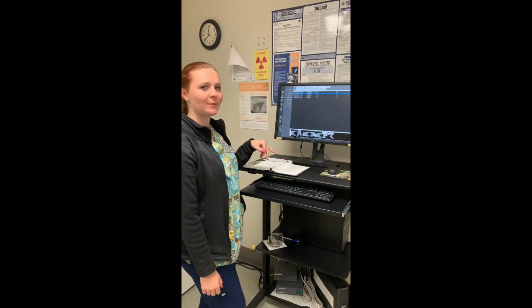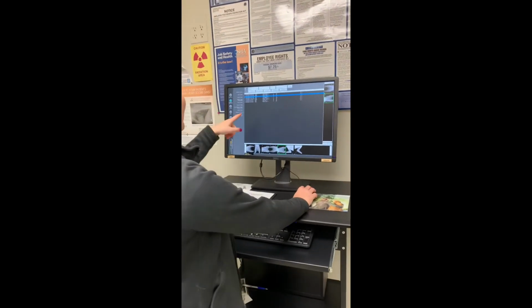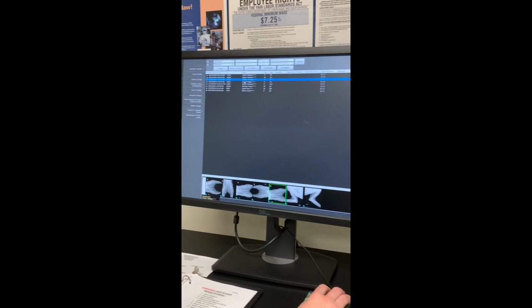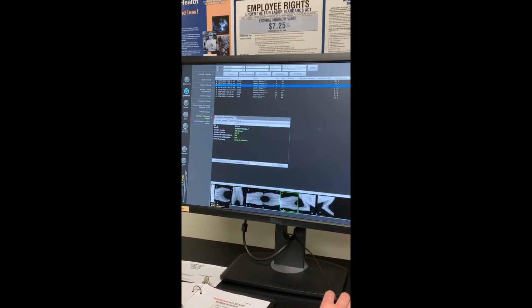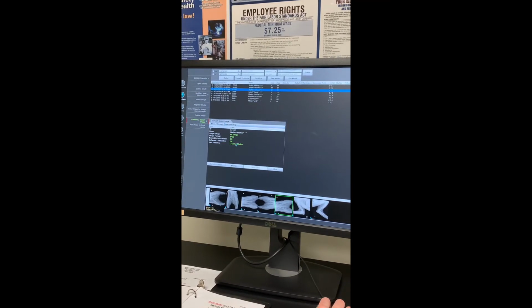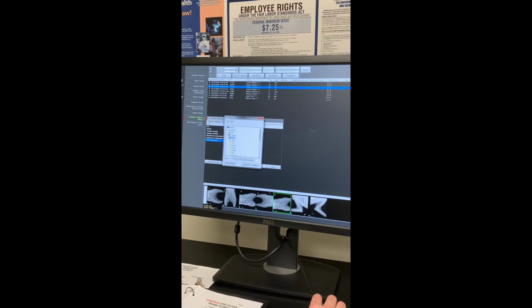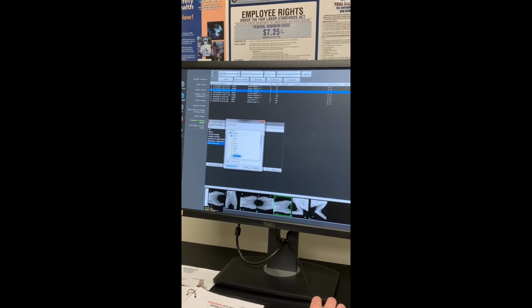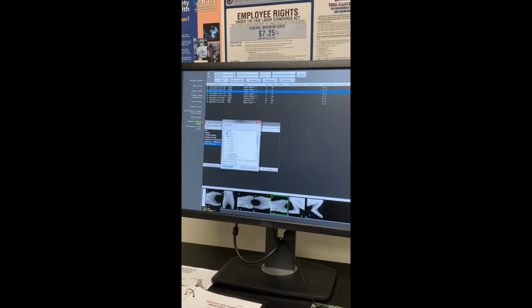So to pull up an image to send out through your email, you want to pull up whoever you're going to send out. I might send out Striker's. You'll click on the convert-export image. You'll make sure that it's on the user directory. You'll double click on the user directory and click on this one, make a new folder, and you'll title that with the animal's name.